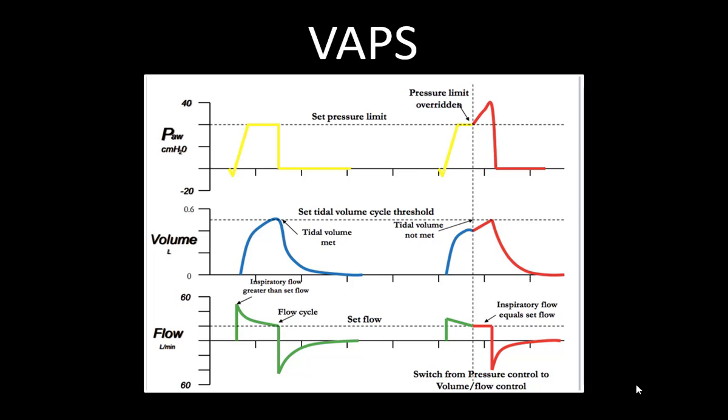As you can see here, this is the volume assured pressure support. This is the pressure waveform, this is the volume waveform, and this is the flow waveform. So this is the set tidal volume. If it is matching, it is okay.